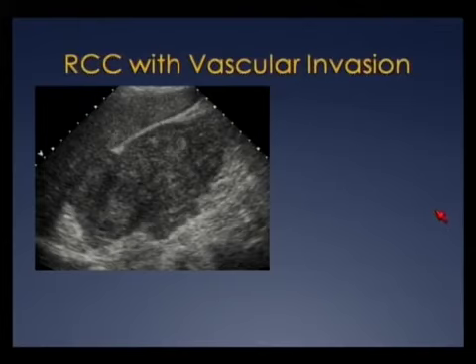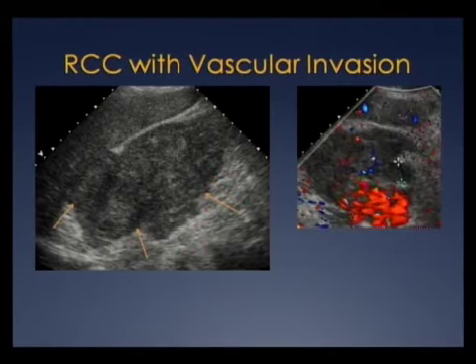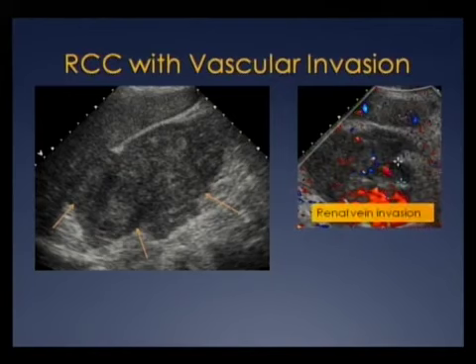Now this is not a well-behaved renal cell carcinoma. This is a mass infiltrating the right kidney, basically. I can't tell what's normal renal cortex and what's mass, and the margins are very irregular. So we applied Doppler, and this is the transverse image of that same kidney. And here, this is the right renal vein, and this is all tumor thrombus filling the right renal vein.